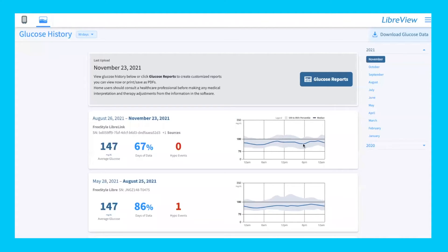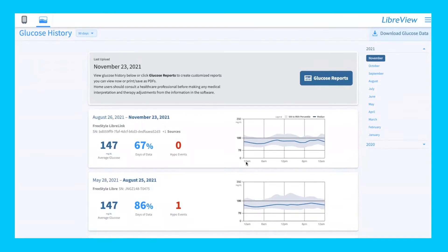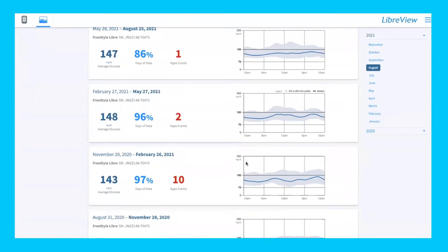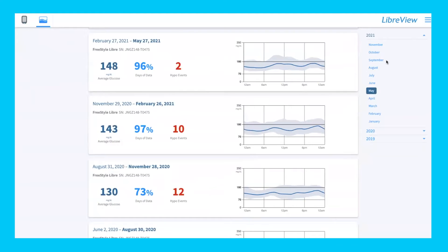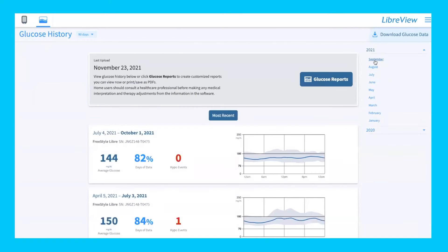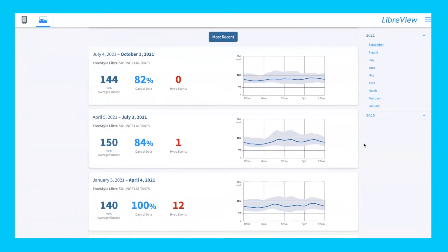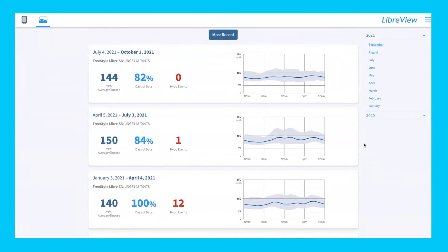The shaded gray area shows your fifth to 95th percentile intervals — it represents your average, but also the lowest and the highest values. You'll see that across several months. On the right-hand side, if you want to look at a specific month, you can just click on that month, and it'll show you all the information from that month.